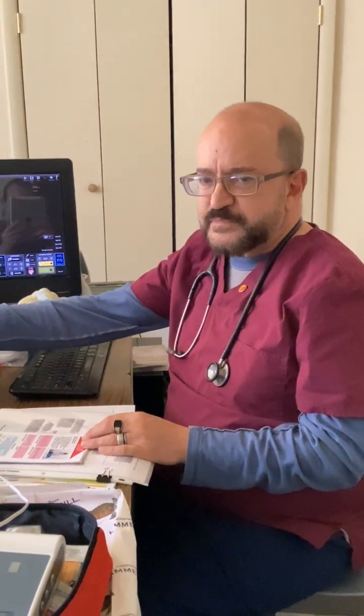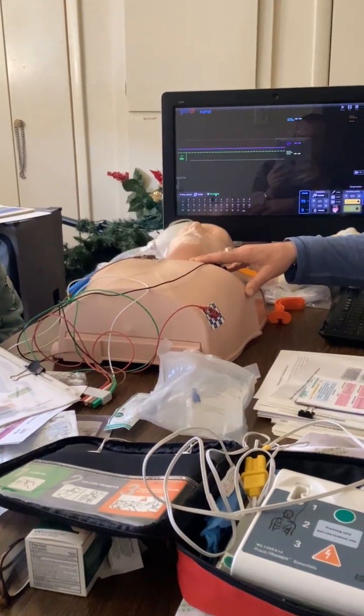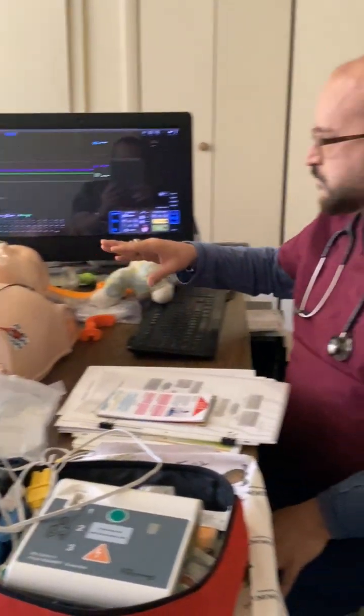And then we're going to introduce CPR for pediatrics, children and infants, single rescuer, 2 rescuer, AED. This mannequin's brand new, so he's kind of a little hard to push. I haven't broken him in yet. So he's a little clunky.